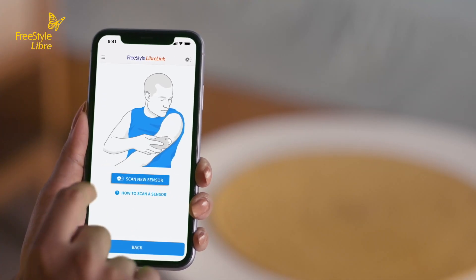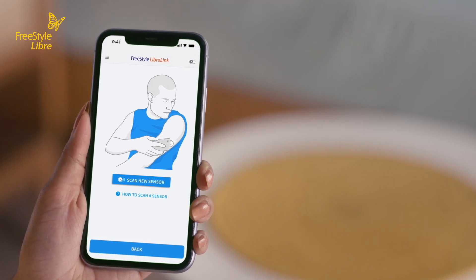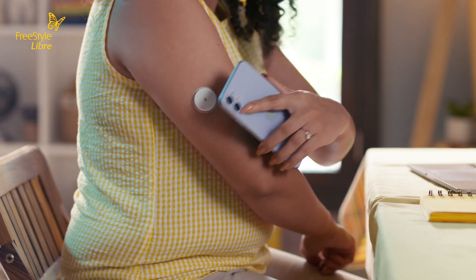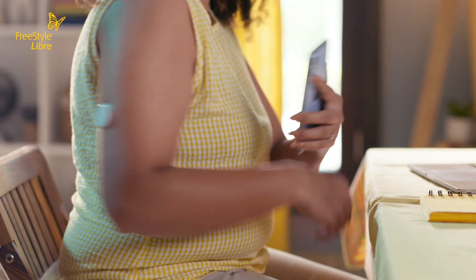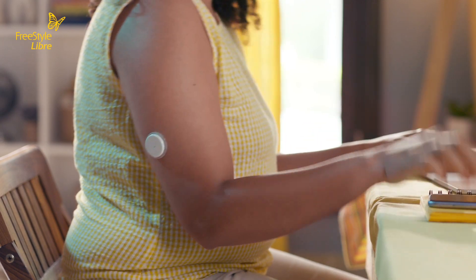If you're using an iPhone, tap either the blue scan new sensor button or the icon on the upper right-hand corner of the app. Then bring the top edge of your iPhone near the sensor. Your iPhone will vibrate and emit a sound upon successful scanning.